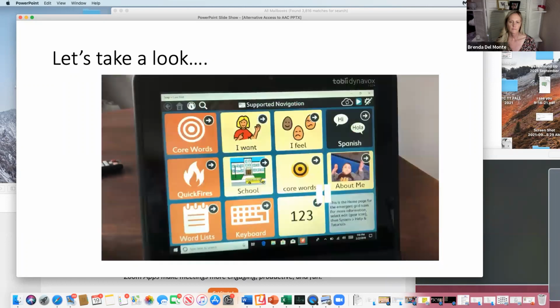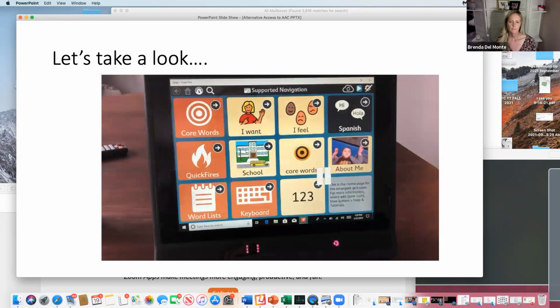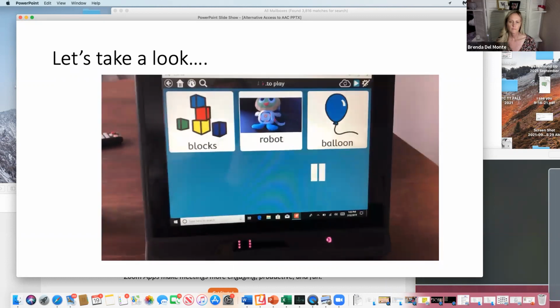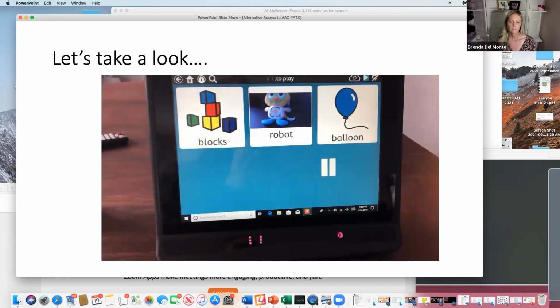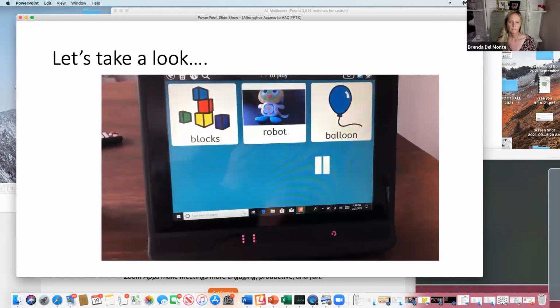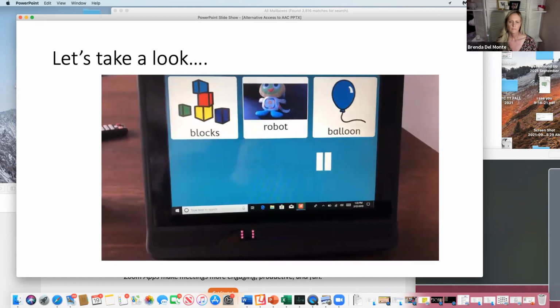So you don't want to do a whole session with him in front of the device. You'll want to have him maybe do I want to play balloon, and then you might bat that balloon in the distance or bring it close to his face so his eyes are not fixated on one particular distance. So the games help him realize that he's controlling the screen and not just watching the screen.